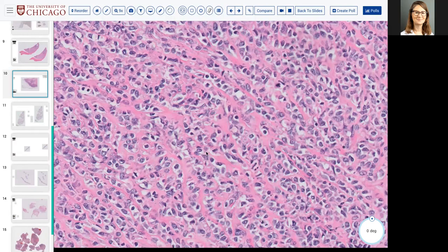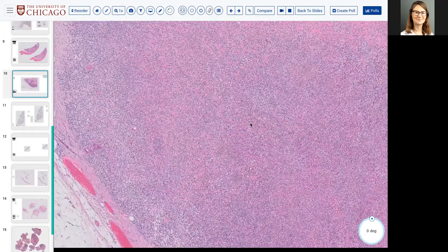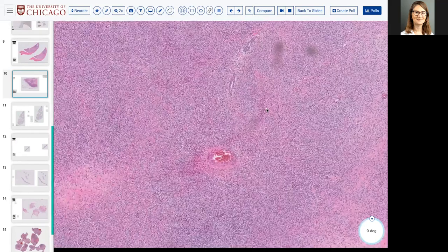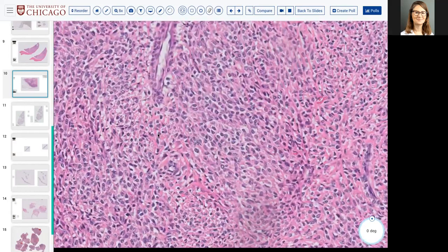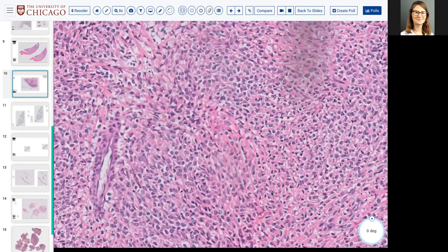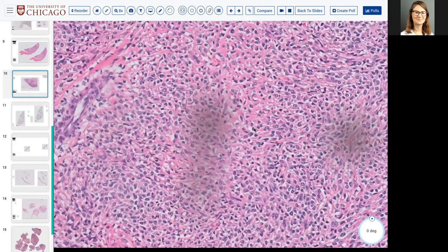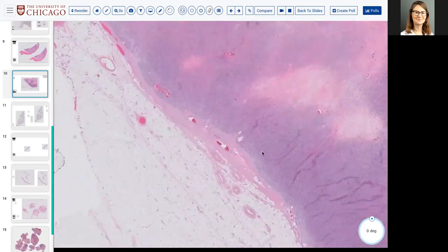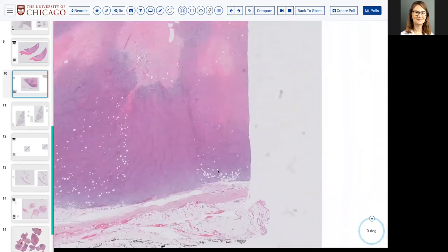So in a tumor that either has low-grade spindle cell morphology with myxoid and collagenous zones, or this much more cellular type of morphology with almost lobular-like bands, think about, oh yeah, there's another area right there that's really nice, think about this spectrum of tumors. And SEF can arise de novo, as I think it probably does in this case, with no pre-existing low-grade area, or it can transform from an LGFMS, okay?